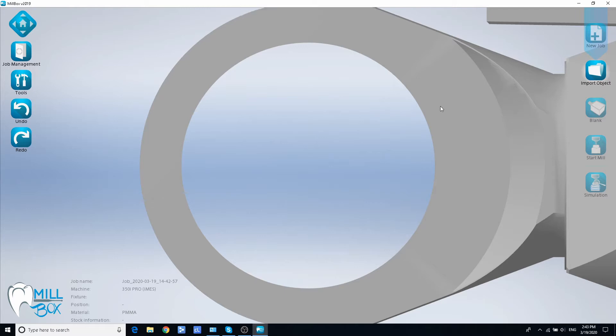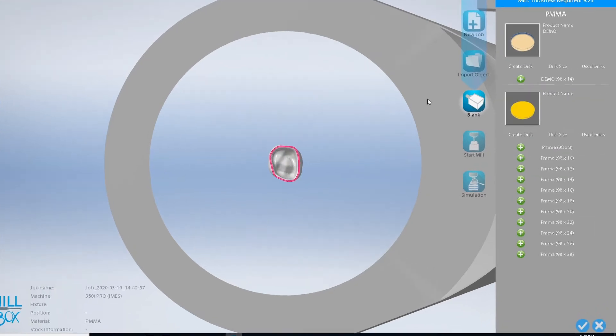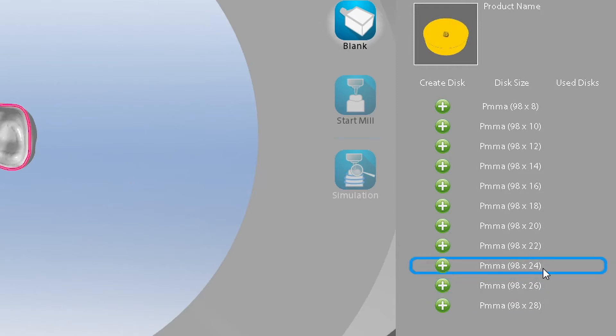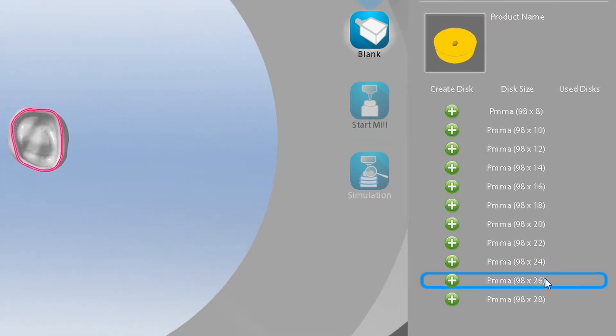For example, we are going to use a 25mm PMMA blank for this project. As we can see here, this blank size is missing in the list of available options.